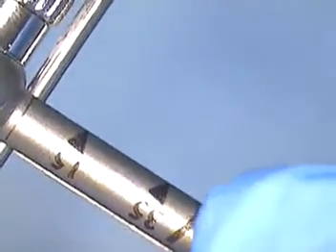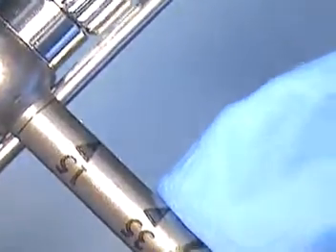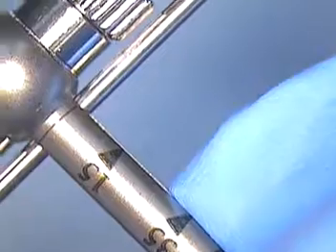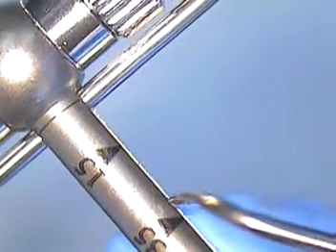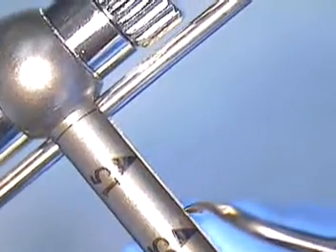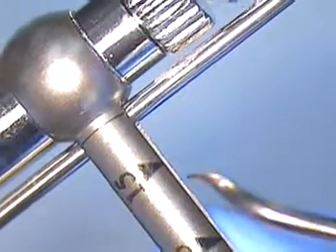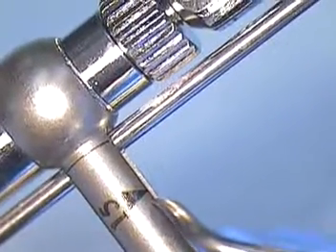Your torque driver, today's torque drivers, really don't give you the number that you need to see. It's obviously 35 and 15 are there, so you've got to estimate just prior to 35 would be about there for 30. What you also could do is just take a magic marker and mark your torque driver. So right about here, and then 20 for the prosthetic screw is going to be right here.